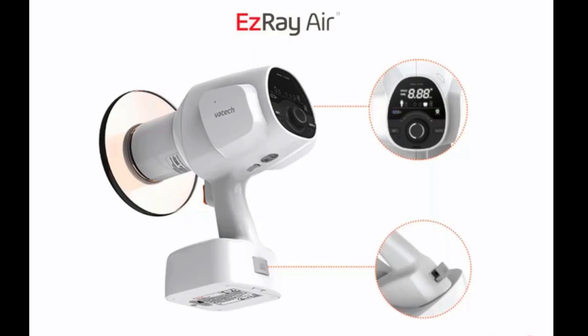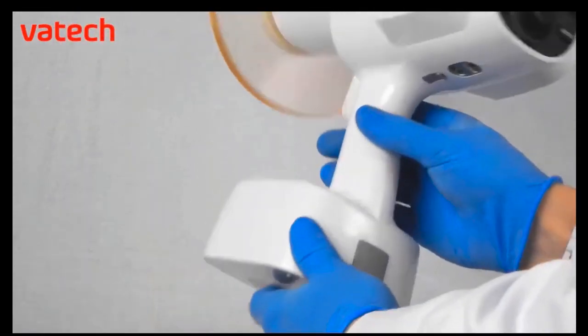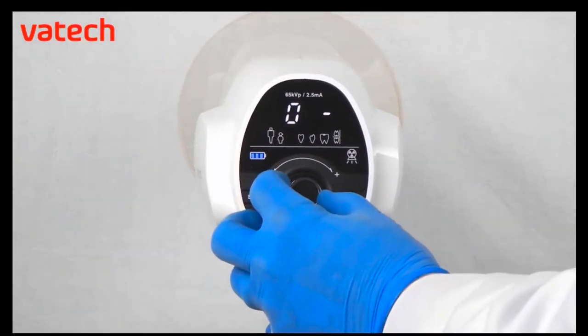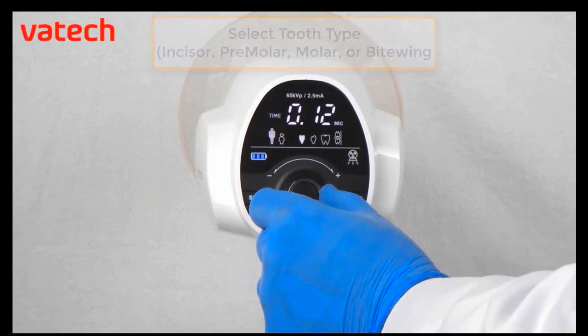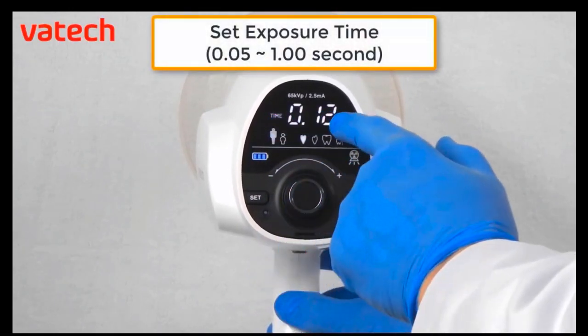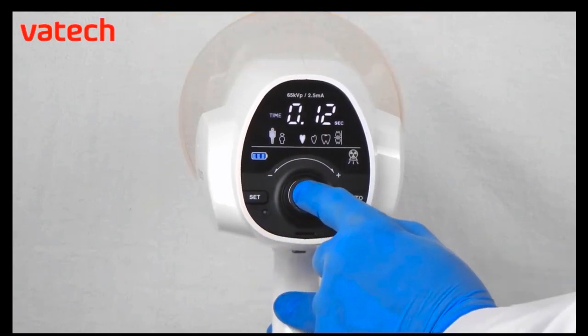I wanted to play a short clip video that will go through the digital touchpad readout, because when you first turn it on there is a passcode. We'll start by lifting the EzRay Air portable and moving the switch from off to on. Then we'll enter our password on the back control panel: turn the jog dial to the left, press the button, turn the jog dial again to the left, press the button, and press it one more time to set the password to zero zero zero. Now we can choose our tooth type between incisor, premolar, molar, and bite wing. We can then choose between adult or child, and lastly adjust our set exposure time between 1/500 of a second up to one second. Press the jog dial to set your exposure time.